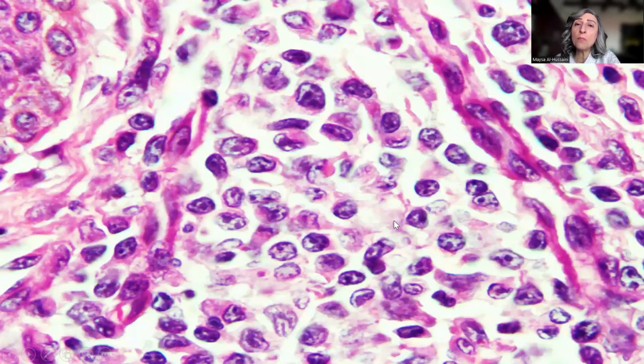Now, on higher power magnification, and this is the oil immersion, just to give you a feeling of the appearance of the nuclei of the tumor cells, some histiocytoid appearing cells here, others perhaps with some cleavage of the nuclei with the prominent nucleolus, kind of cerebriform appearance, and again here another form of the nucleus with the nucleolus, and some abundance of the cytoplasm. But in general, if you see, the cells are more or less similar to each other.